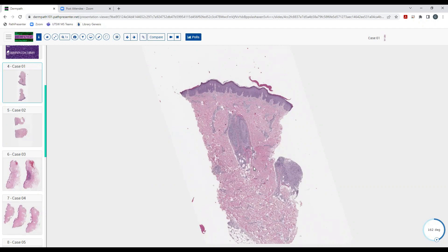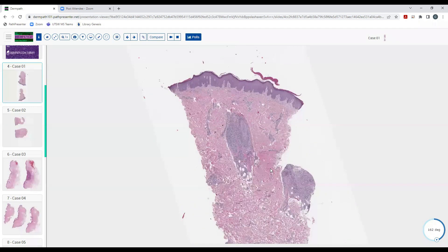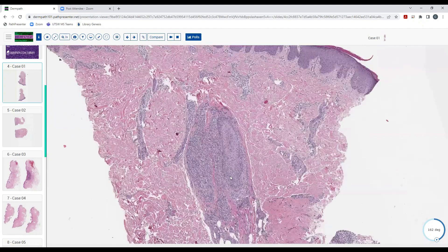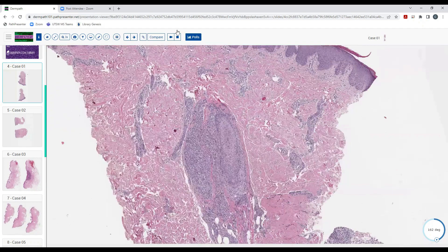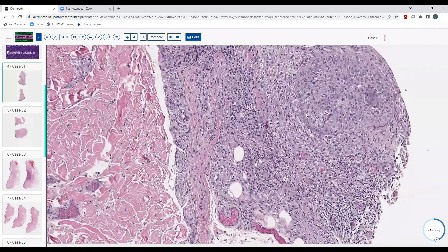We have a punch biopsy and the business is kind of around this hair follicle — that's the key. There's almost a nodular infiltrate around it that also tracks into the fat around the hair follicle, and there's some inflammation around the adnexal structures as well. It goes sort of deep here too. What kind of inflammation do you think this is?